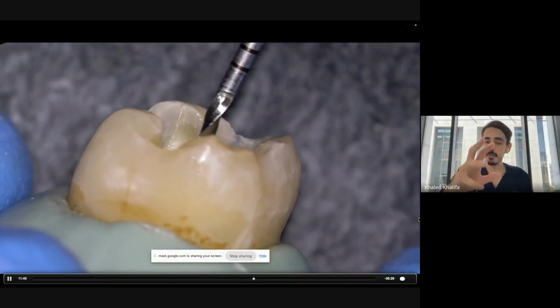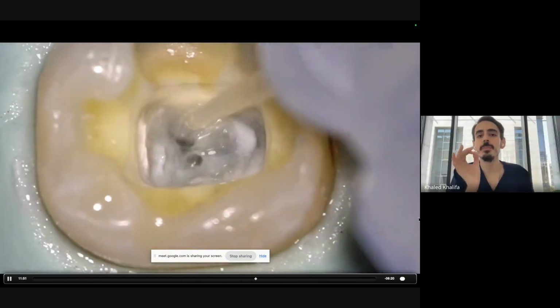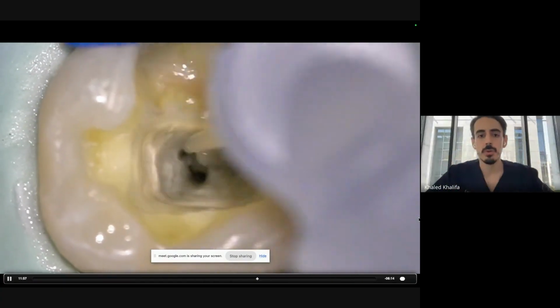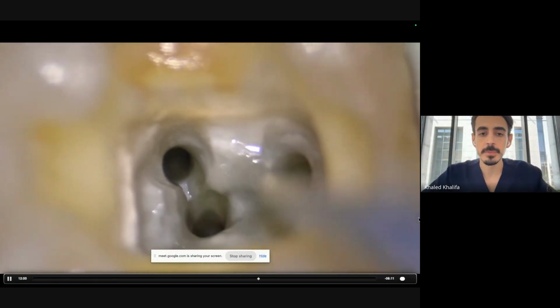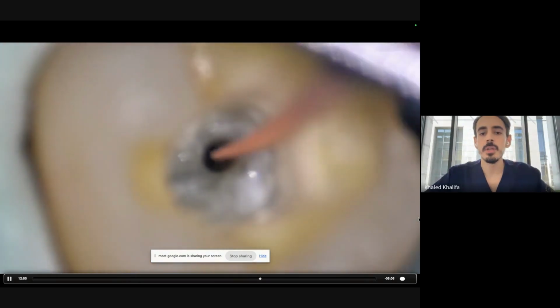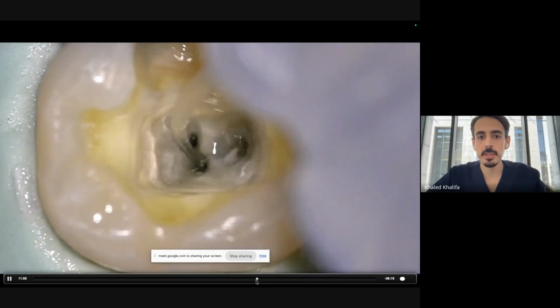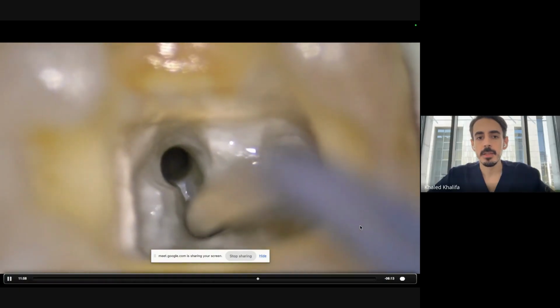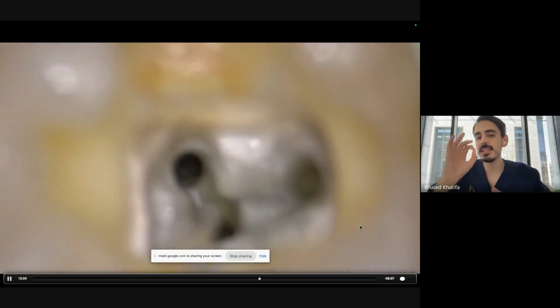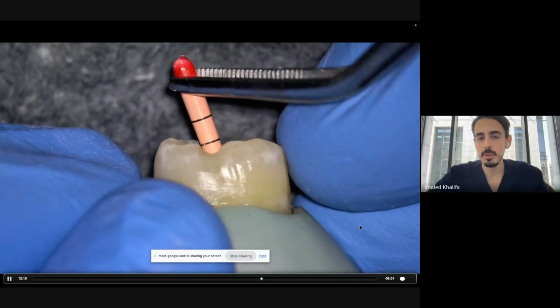And I told you when to pick 25 taper 6 and when to do 25 taper 4. As you can see here, it's doing reciprocation when there is resistance, and when it enters a curve, for example. Okay. This is a microsuction. I don't know if you noticed now. Before obturation, I do a microsuction. Look again. The microsuction, I entered in the mesiolingual canal and it took the solution out of the mesiobuccal canal. This is an indicator that these canals have communication, either a type 2 or an isthmus in between.